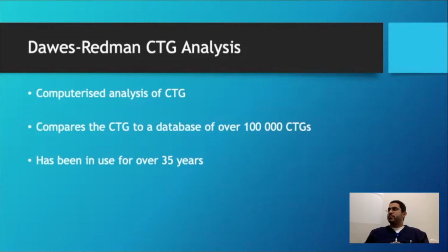What about if there's just some tightenings on the CTG from Braxton Hicks or something like that? So if it's just tightenings, you're barely palpating them, you can. Okay? But if you are in threatened preterm labor or she's feeling contractions, you shouldn't. Okay? There was an incident where we were criticized over whether we were using it appropriately, because she came in a couple of hours ago with threatened preterm labor, even though she's not contracting right now.